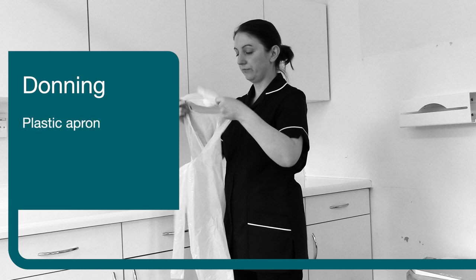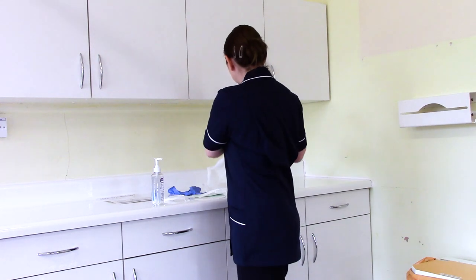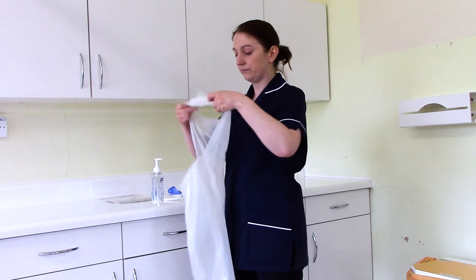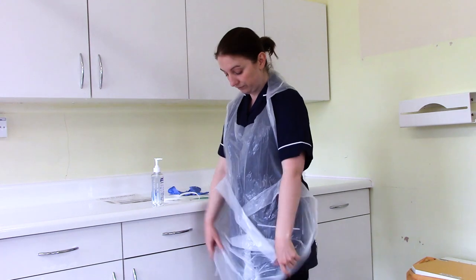Step one: plastic apron. Pull the apron over your head and fasten securely using the ties at the back of the waist.